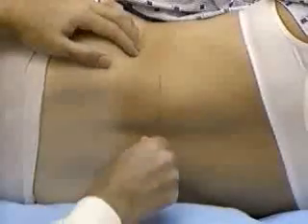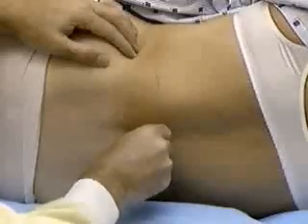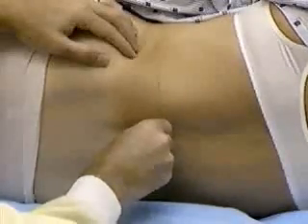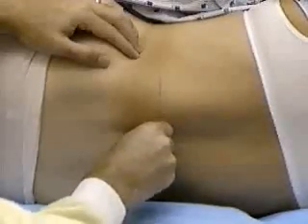Next, position your patient in the lateral decubitus position. Keeping the shoulders aligned with the plane of the back, your patient should flex his or her knees toward the chest, bend his or her head downward, and arch out the back. At the level of the superior iliac crest, palpate for the soft interspaces between the firm spinous processes. Mark this spot.